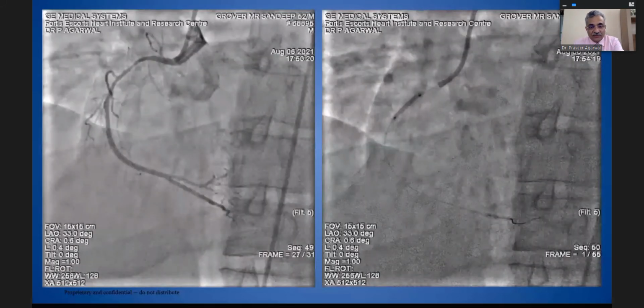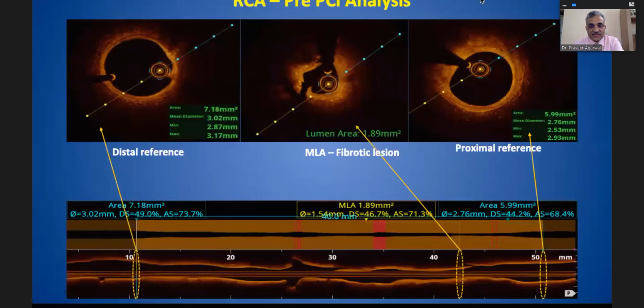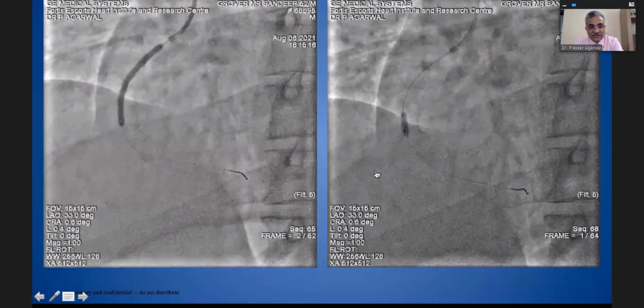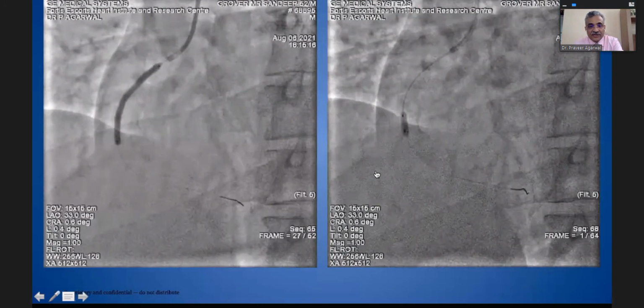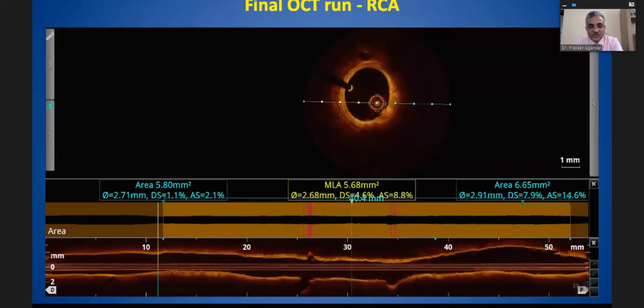Now see this one, again the same patient with the RCA, which again will behave in the same way. And see the fibrosis, it's a gross fibrosis in this area. See this whole area. Again, the same strategy: put a cutting balloon of nominal size, because we opened it to 2.5, we'll use the same balloon. And a 3.0 scaffold here, and then 3.0 dilatation. And just see the OCT run. The stent is looking very well deployed, and you see that it starts looking so beautiful.